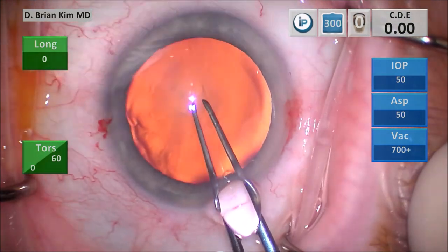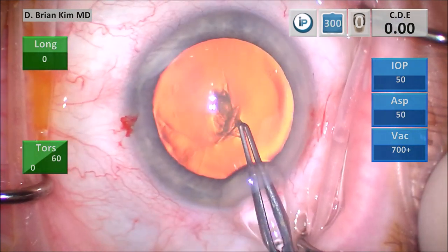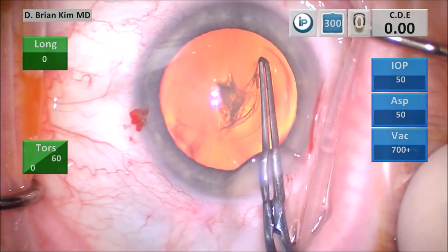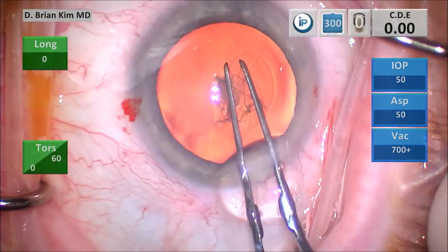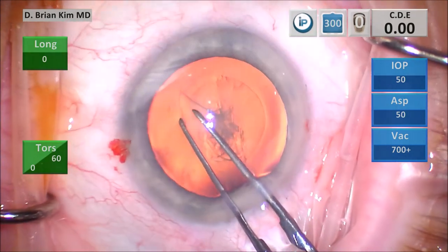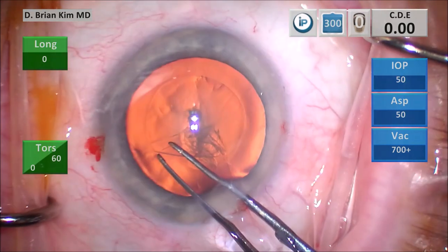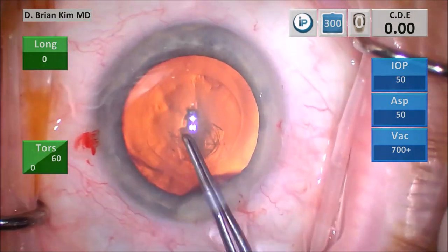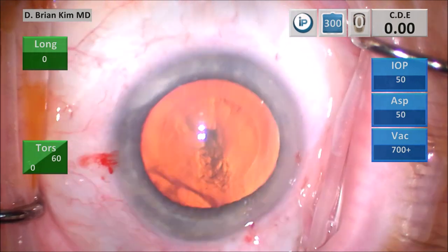This is my puncture-style capsulorhexis. I'm going to puncture with the teeth of the forceps, pull downward towards my incision, and then create a flap on the right side. I'm going around circumferentially, grabbing and re-grabbing, making sure I'm trying to stay within the corneal marks, which will help me to center and size my rhexis.